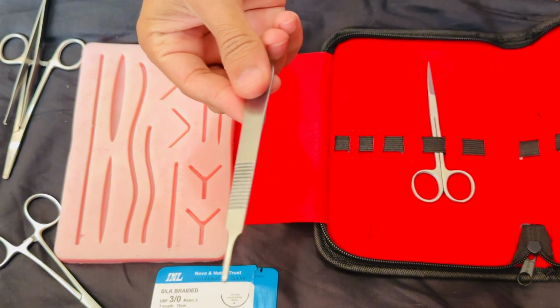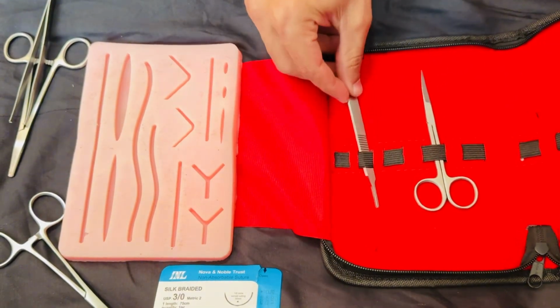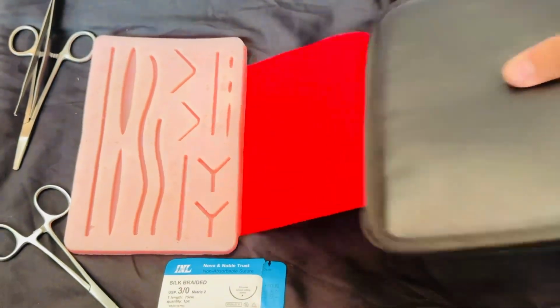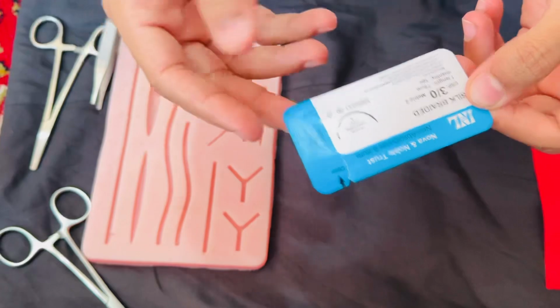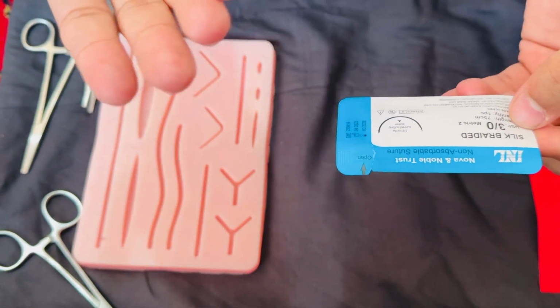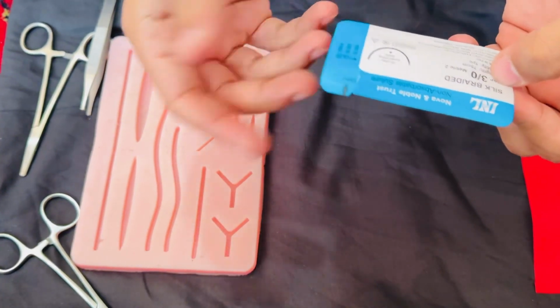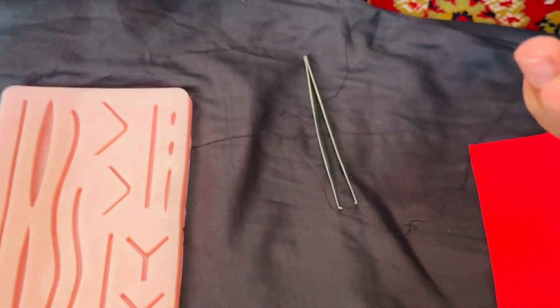So I have unfortunately broken the scalpel, so you will have to compromise. Otherwise, I would have told you the technique to insert the scalpel into the scalpel holder. And apart from this, the main important thing is the surgical thread or suturing thread, which is silk braided. Mostly silk braided threads are used for surgical procedures involving the epidermis or the skin.